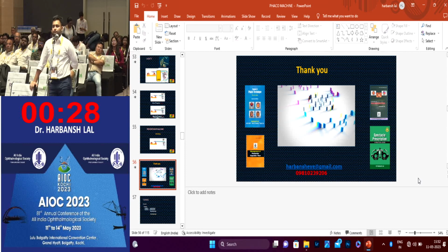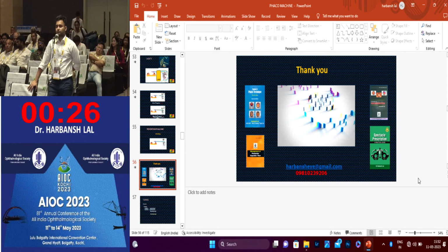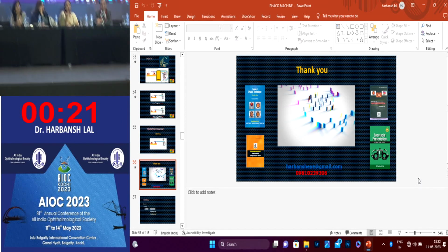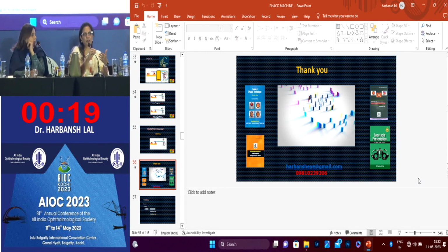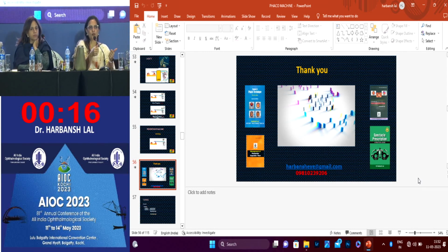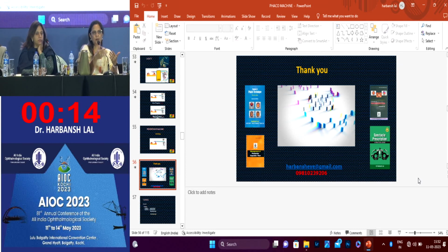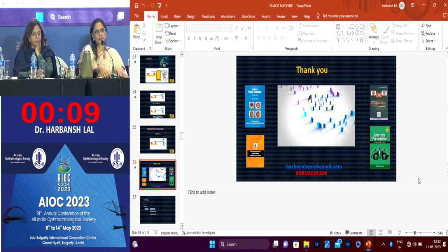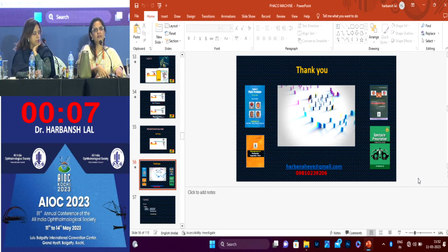So the pulse mode, of course, once there are the oscillations, we don't need to use the pulse mode per se. But there are still occasions when your tip gets occluded and it's not coming. You do give one short pulse to let you get past that. Burst mode, I don't use personally, but I think burst mode still has a role in the very hard cataracts, when you want to just bury into it and hold when using the direct chop. I think there is still a role for burst mode. But yes, the newer machines have made it a lot easier.